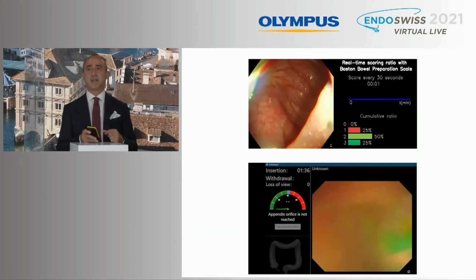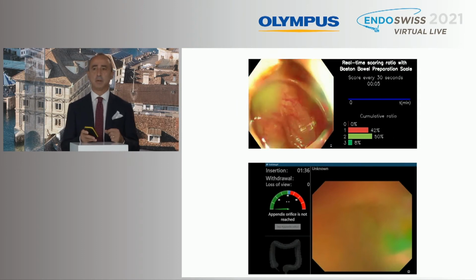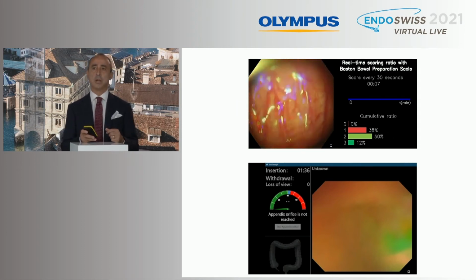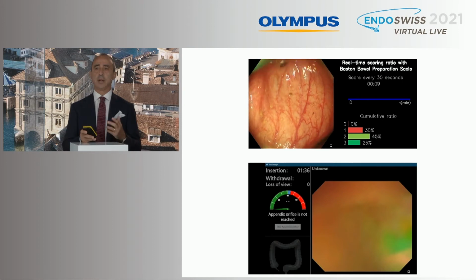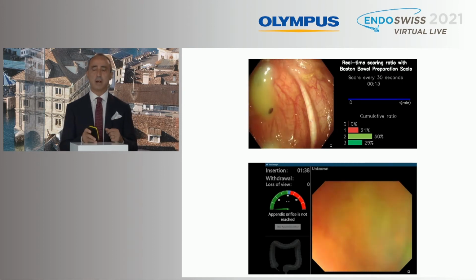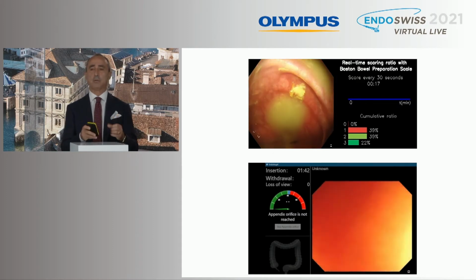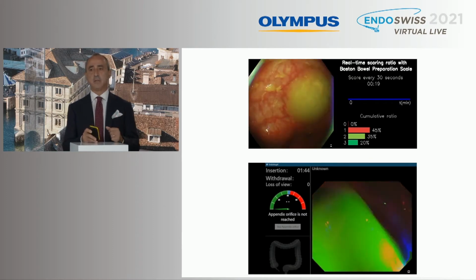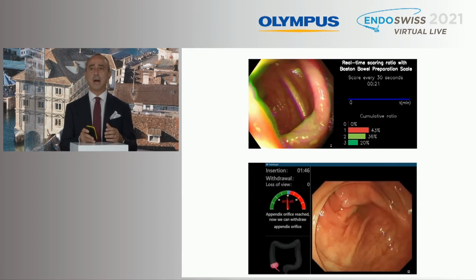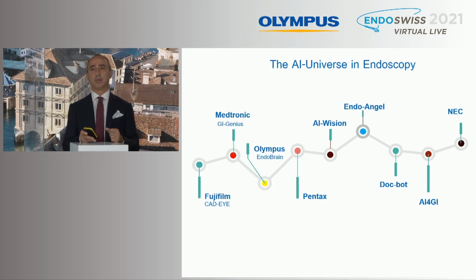So also when we say quality control, these are videos from the EndoAngel system developed by Honggang Hu in Wuhan, China. So now the system can tell us about the Boston score, and can also guide us in terms of withdrawal time. If you are going too fast, it just gives you the suggestion to slow down and make sure you are exposing properly the entire mucosal surface.